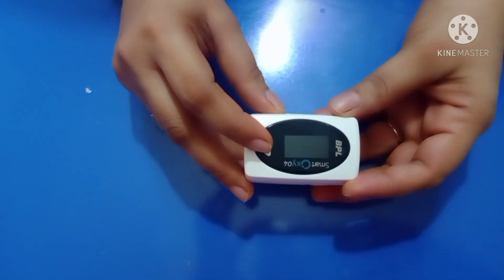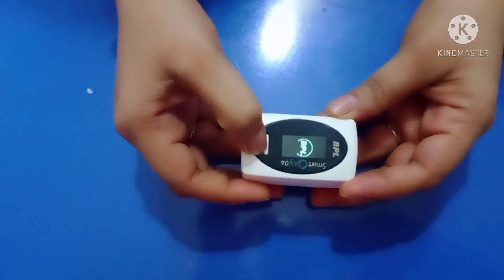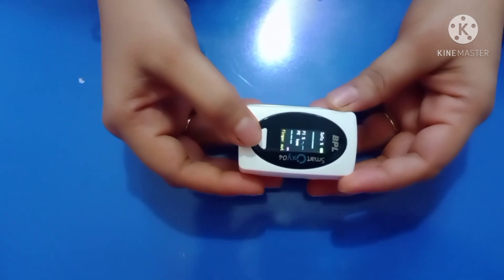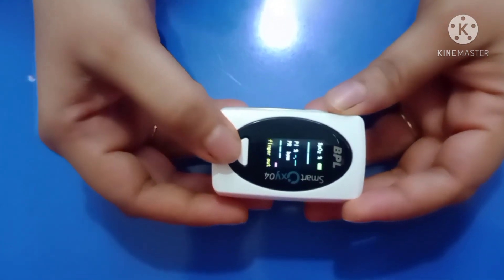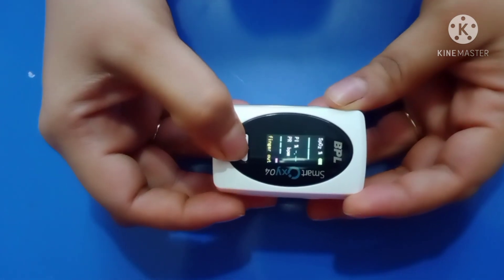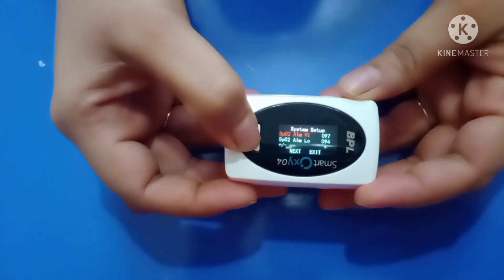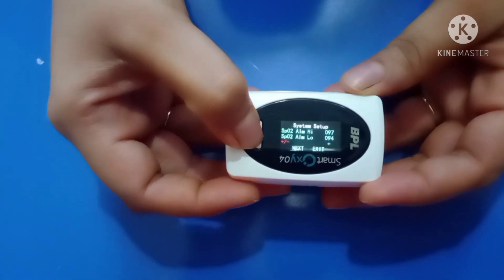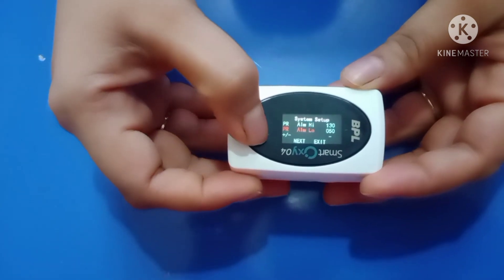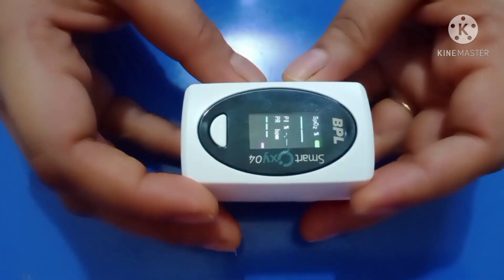This is the switch on and off button. When you turn it on, it shows various parameters which it measures along with the unit. There are various settings available too. There is also a power indicator.